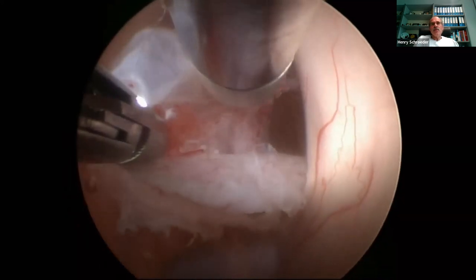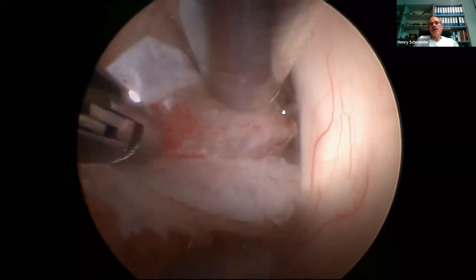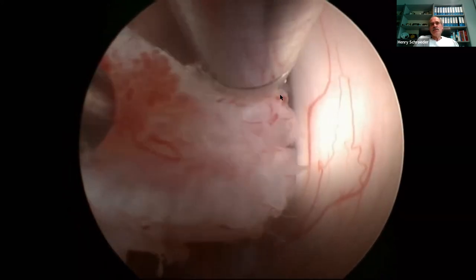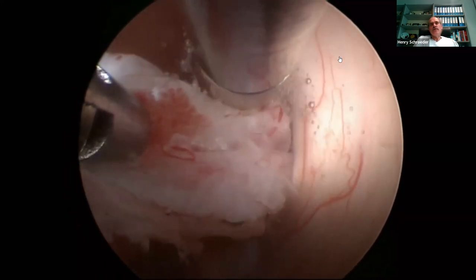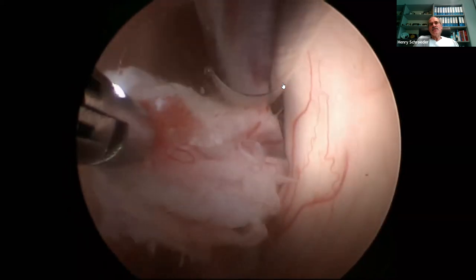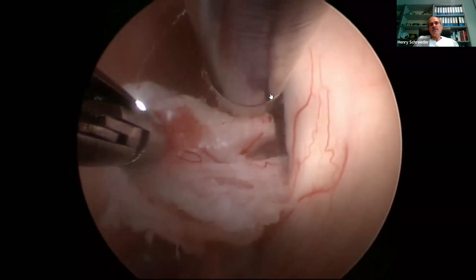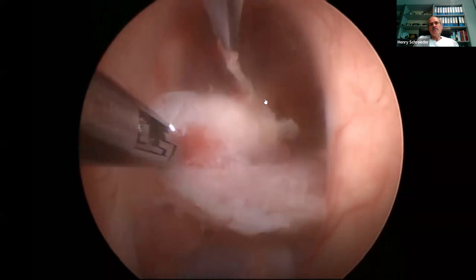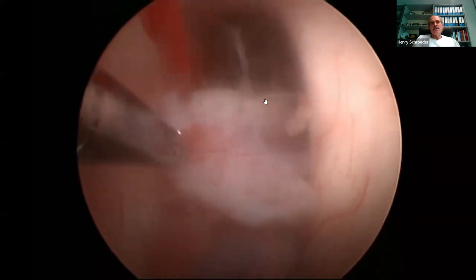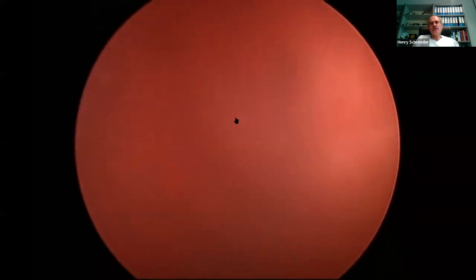There's another example. It's a colloid cyst. You see, by manual technique, I have to pull on the cyst to get access to a small artery, which is attached to the cyst and comes from the tela choroidea of the third ventricular roof. So I coagulate, you see, three or four times, and I thought this might be okay. And then I take my scissors, puff, oh, too early. You see, it starts to bleed, vision becomes blurred. So I leave the cyst and go to my irrigation.